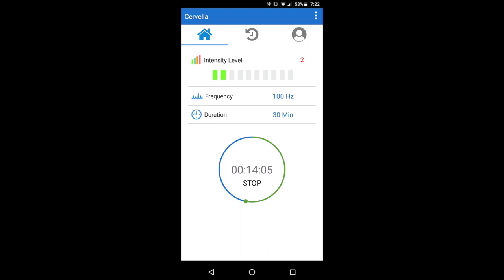Ensure that your smart device — a smartphone, for example — and audio source, which can be the same or different from the device running the Cervella app, is Bluetooth capable and features Bluetooth version 4.0 or above.